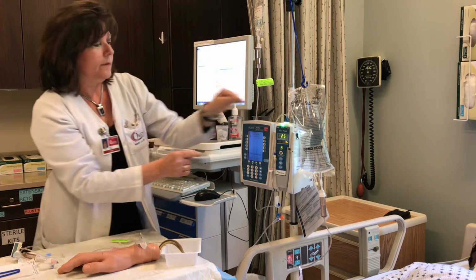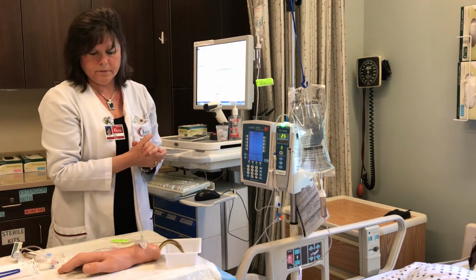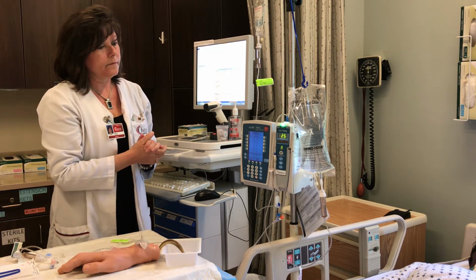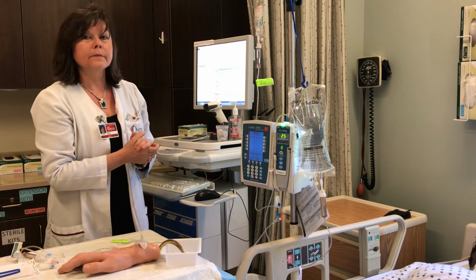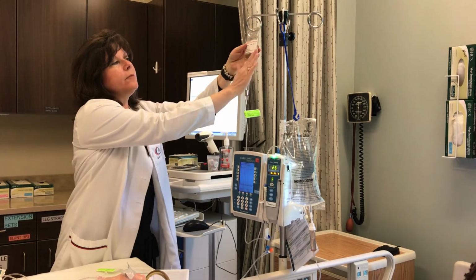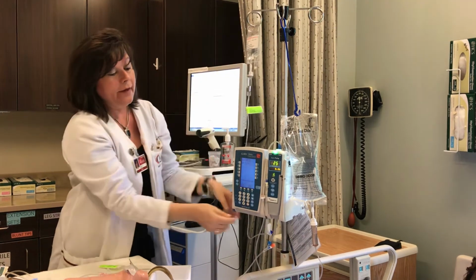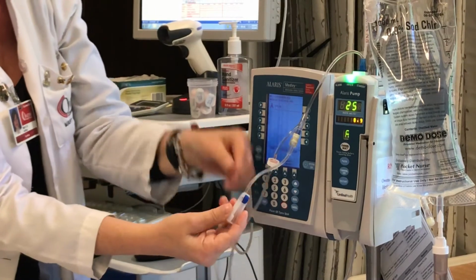Return to observe the patient following completion of the infusion. Close the roller clamp on the IV piggyback tubing. Return the primary IV fluid to its original position. Check IV pump to verify that the pump has reverted back to the primary rate. When I walk back in the room, I'm going to verify that my IV piggyback is completely infused. We would simulate this bag is completely empty. So then the first thing I would do is close the secondary tubing clamp.